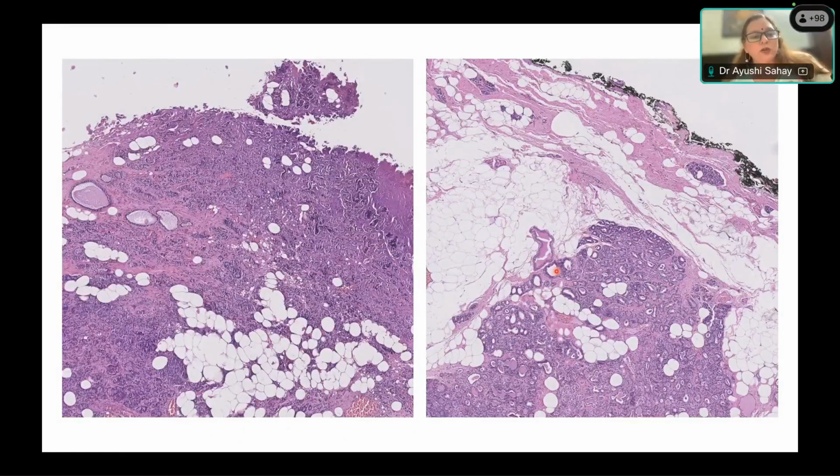I don't think the pathologist who has given MGA should get into any trouble for it, except that you need to know that many of the clinicians are not aware it's a rare entity. They need to be aware that because you have called it adenosis, it does not mean that they can leave the patient alone. It needs to be excised. So maybe you can have a conversation with the surgeon. We have to communicate it orally to the surgeons, not only by the report. Yes, many of them are not aware of the implications. So excision is essential, but I think Seema wanted to say something.